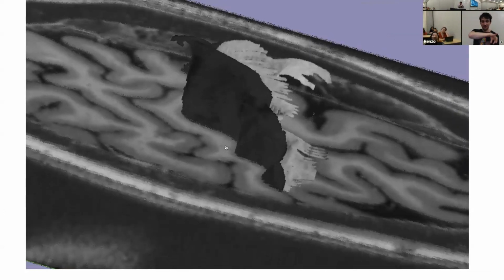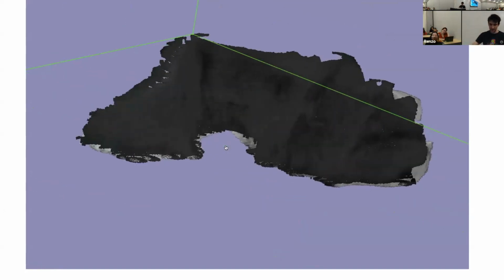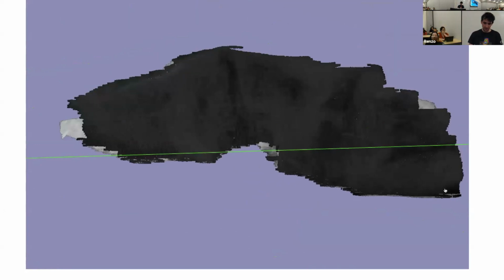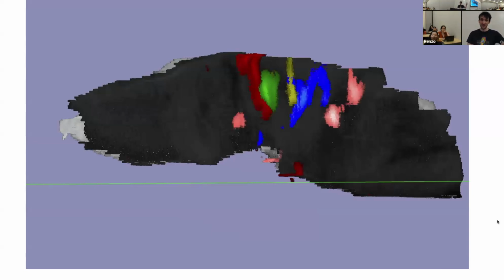And then we can rotate this around and look at this now from the perspective of the back of the brain. So this would be the midline of the brain, and here we would have the right ear. And then I can project the individual fingers onto it. Now on the sensory cortex, the pinky finger, the ring finger, middle finger, index finger, and thumb. And you see in the sensory cortex, this is all well behaved. Neighboring fingers on the hand are neighboring in the brain. And we have this homunculus model.